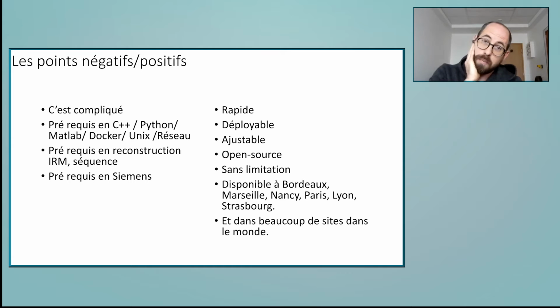And the most interesting part, I think, is that it's open source, so you can really look at the code and understand everything if you want. There is absolutely no limitation on what you want to do. As the code is open, you can now put MATLAB, Python, Julia, and C++ code, and you can have all of these gadgets separately in the same reconstruction process.